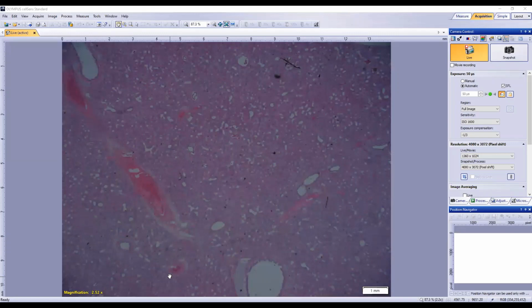So as soon as you see that pattern, you can go, oh right, this is my canned abscess description. These are the particular things I'm looking for, confirm, and just write them straight out. It saves a heap of time. So let's put some structure around the descriptive terms for what you've just talked us through.